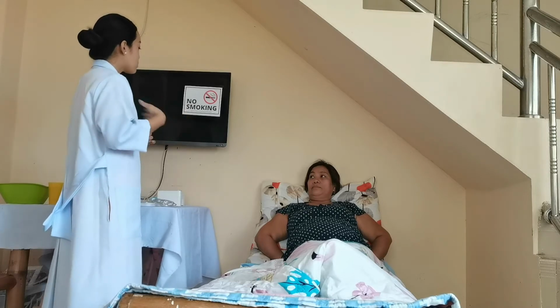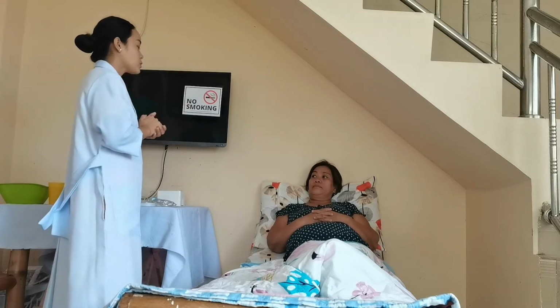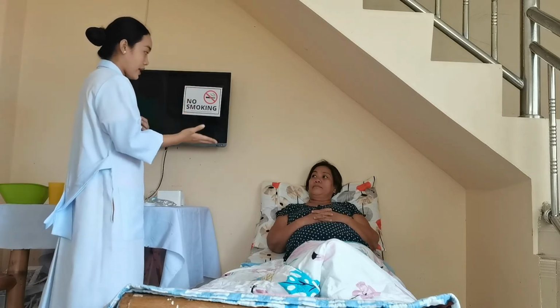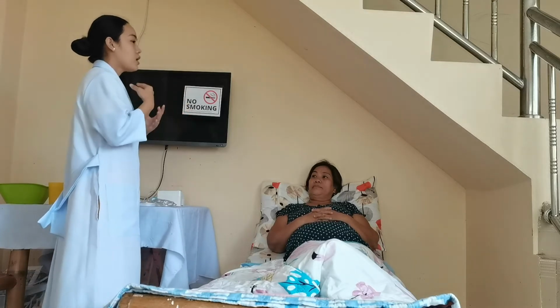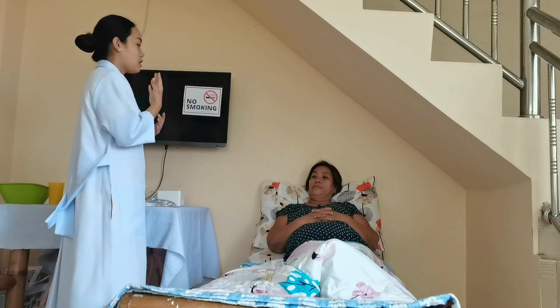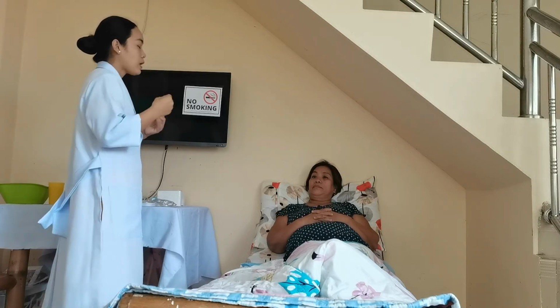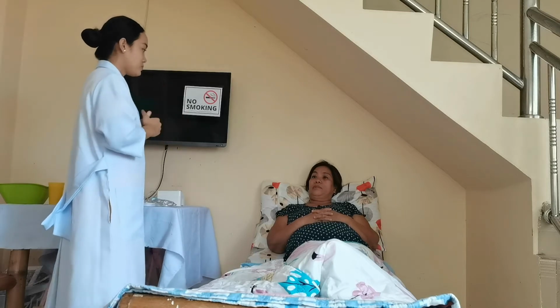So ma'am, yung gagawin po natin ngayon is magne-nebulizer po kayo na may gamot po. So, alam niyo naman po yung nebulizer, di ba po? So, gagawin po natin to para po mapaluwag po natin yung mga nakapakat na plema po sa lungs po natin. So, para po mas madali nyo po mailabas. So, okay na po ma'am?